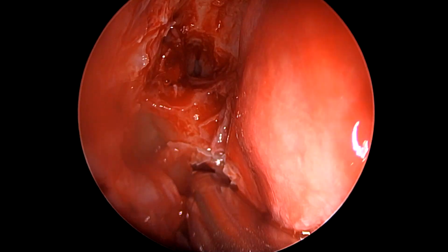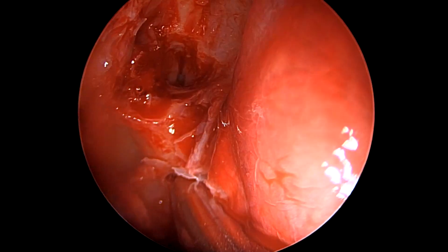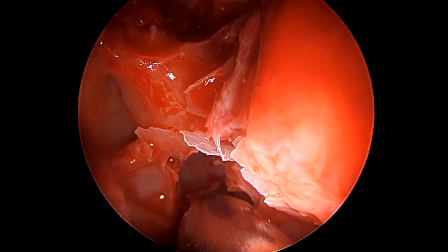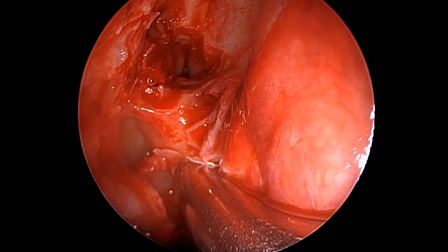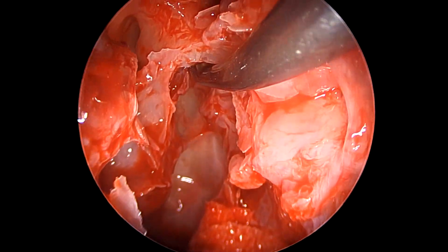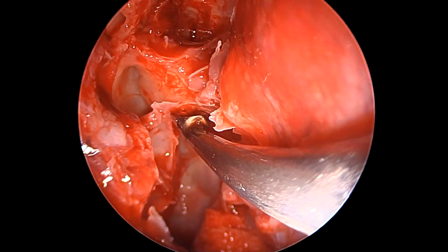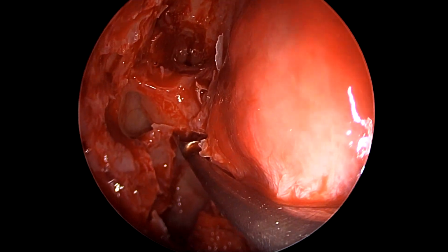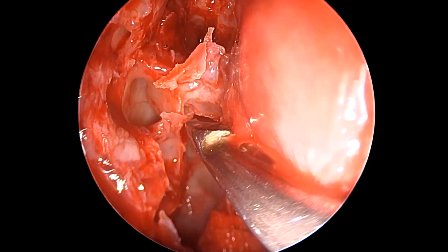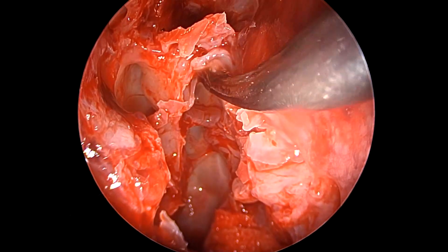So a slight anterior ethmoidal cell is still left open. We'll first need to remove this anterior ethmoidal cell that sits between us and the skull base. As we see here, we're using a 70-degree camera to see inside that cell. So now we can use a curette or an angular microdebrider blade to remove this cell, fracture it anteriorly to be able to locate the skull base and improve our perspective of the approach towards the frontal sinus.